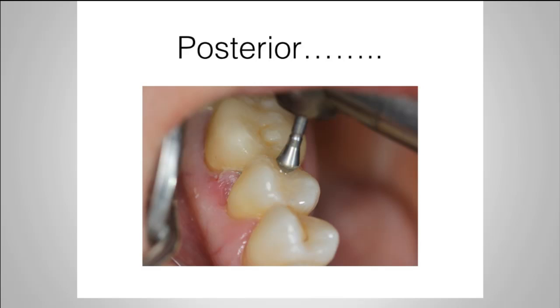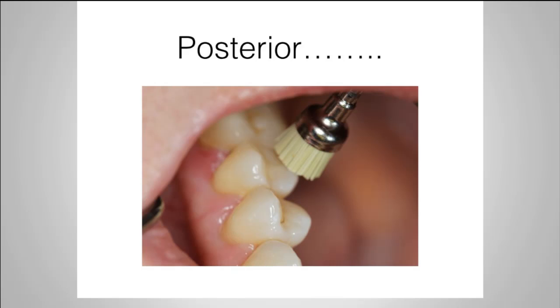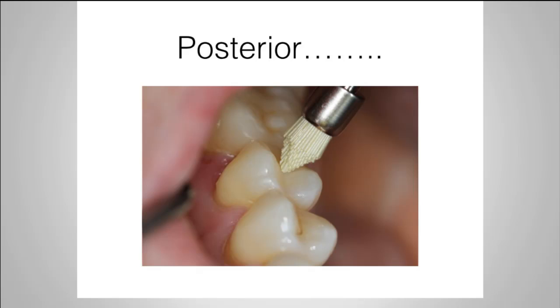But I like this in terms of it allows me to put in some nice occlusal restorations, in terms of the pits and the fossae and all those different things that we like to do. Another one of their burrs is a non-cutting fissure burr, a fluted carbide burr that allows you to go ahead and place some anatomy. Here are the PDQ points that I use a lot, the brushes. There are diamond-impregnated silicone particles that allow you to give a really nice quick shine, and easy to use different points, different accessibilities, things that can help you get through that in a relatively nice way.